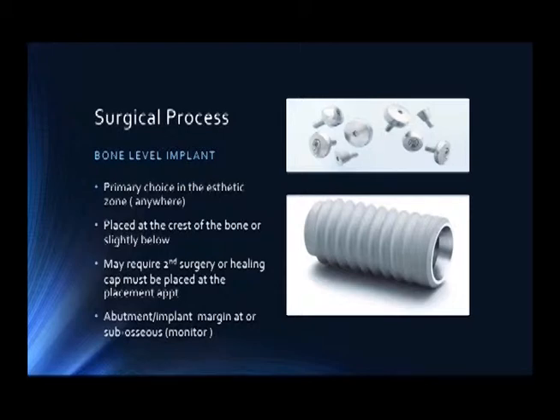Sometimes it requires a second surgery to expose the top of it, or it has to have a healing cap placed on it. And then the abutment and the margin for the crown is basically at or just slightly subosseous.